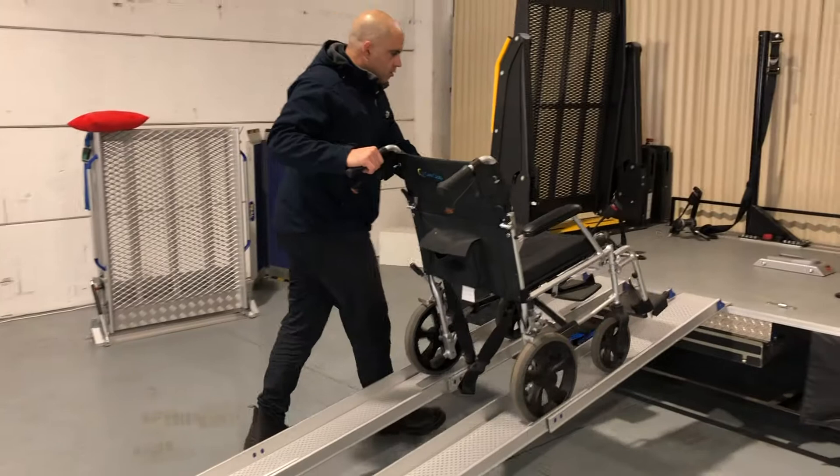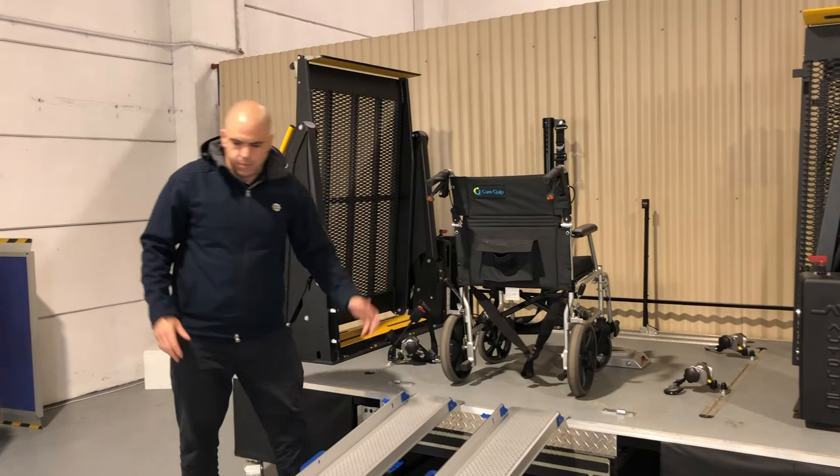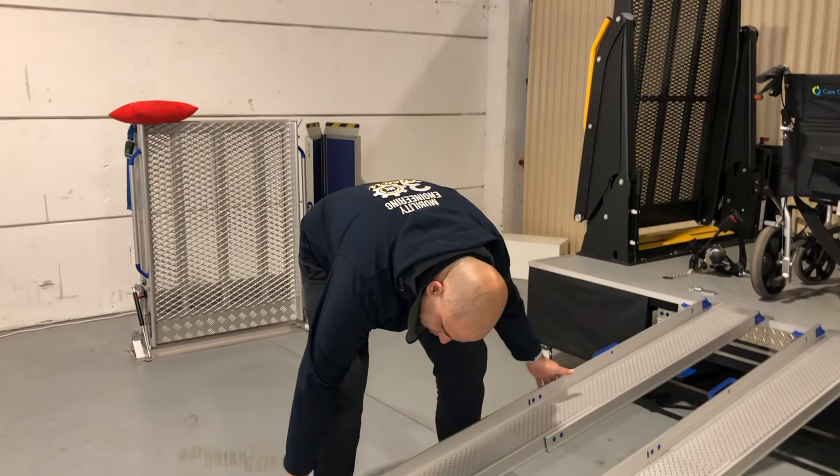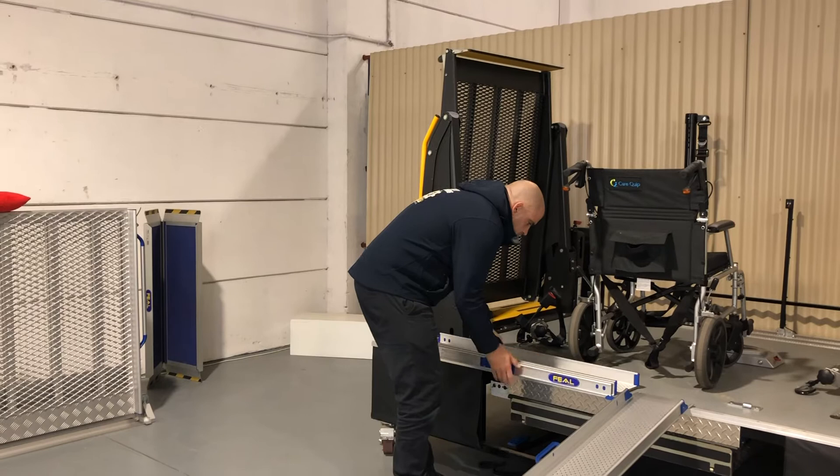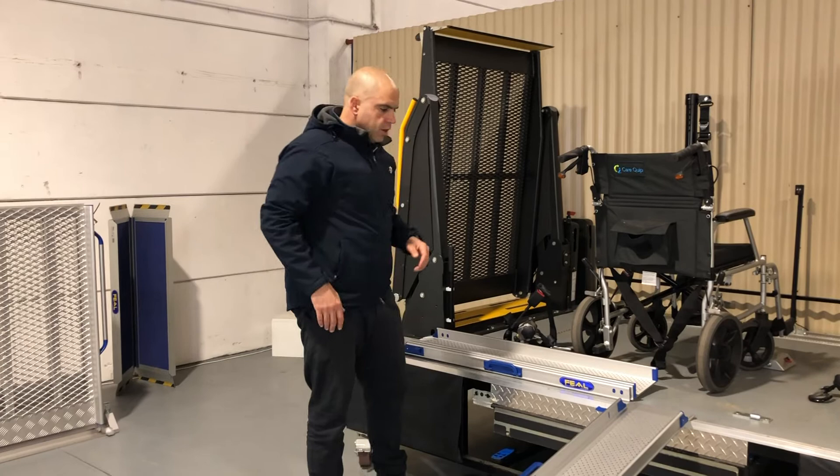It's very easy to use and very easy to pack away as well. To pack it away, I simply pull it up — it's got a smart system that understands when it needs to be moved. For nice, easy storage, we can put it up the side in our vehicle or keep it in the side of the garage and away it goes.